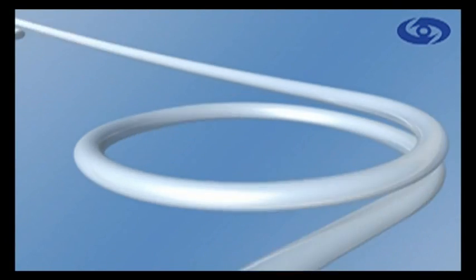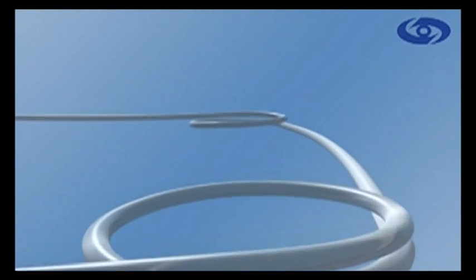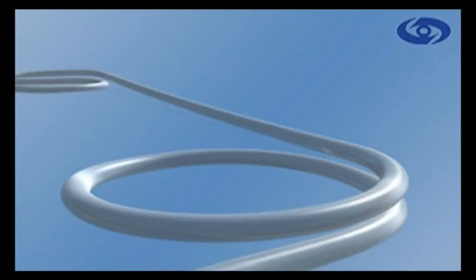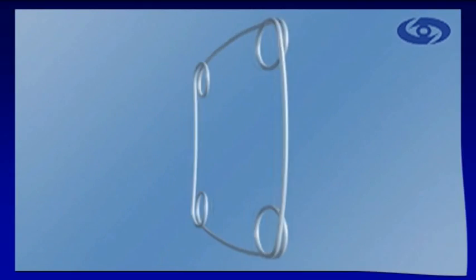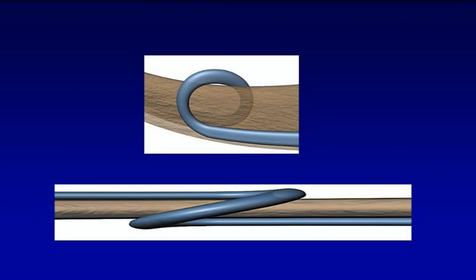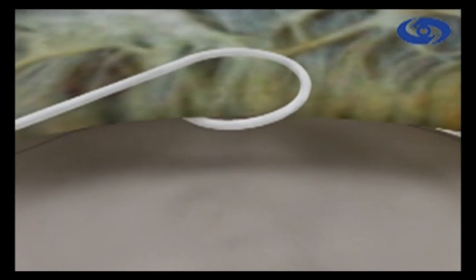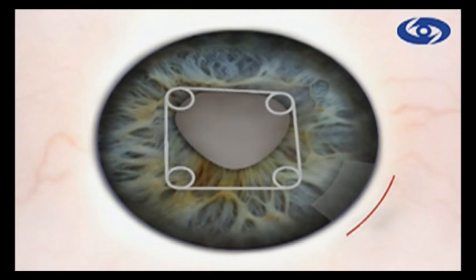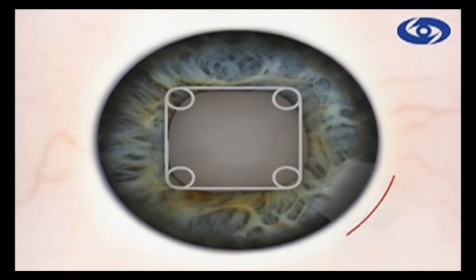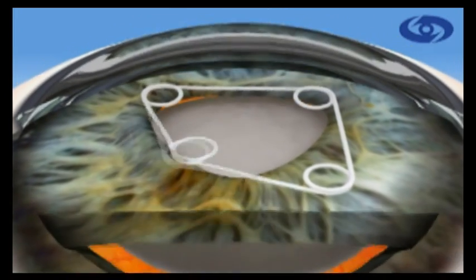At the Fyodorov Eye Microsurgery Clinic in Moscow, we designed a new square ring-shaped temporary implant with four circular loops that hold the iris at equidistant points. The loops of the device hold the iris securely and atraumatically. The result is a square, well-dilated pupil that allows for safe and comfortable maneuvers. The device provides stable mydriasis with no trauma to the iris tissue and no need for additional paracentesis.